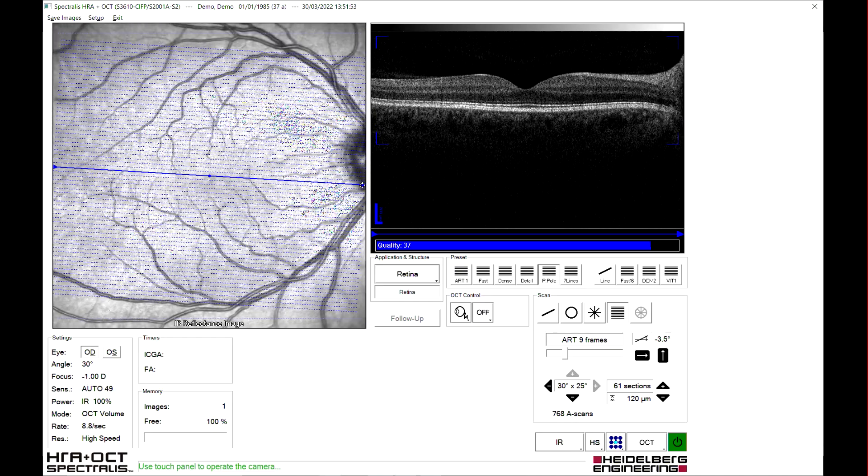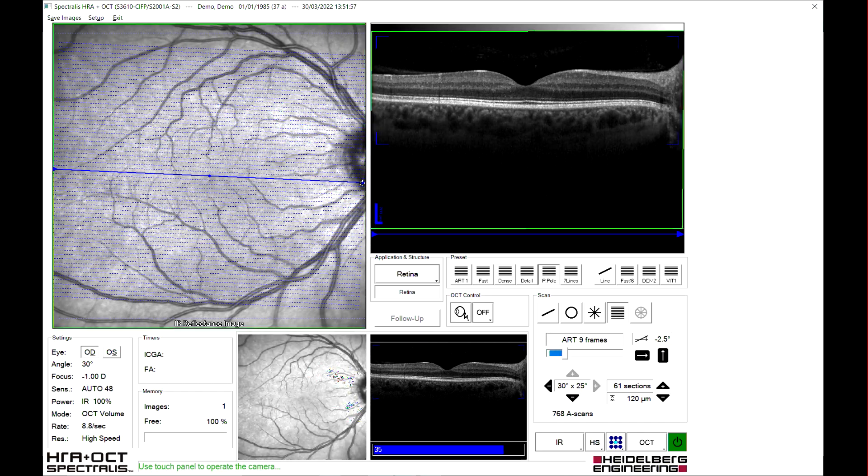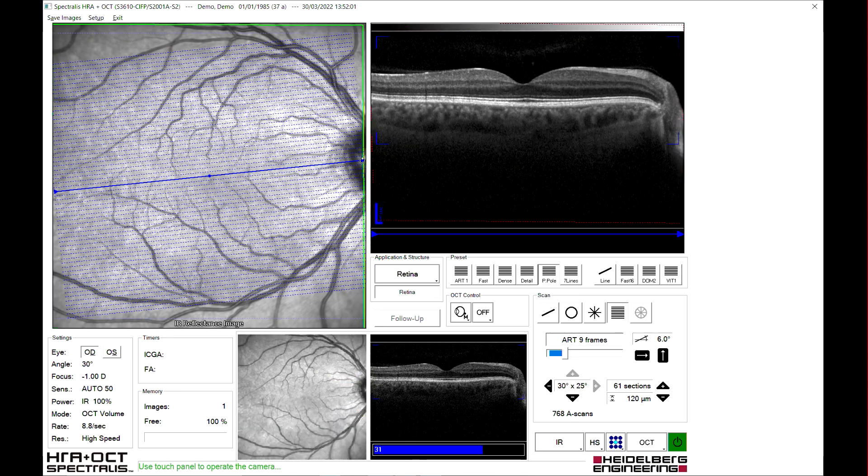Considerations for posterior pole. When retinal tracking has been engaged, the scan line should be adjusted to cut directly through the centre of the fovea, with the nasal end of the scan line positioned at the centre of the disc.